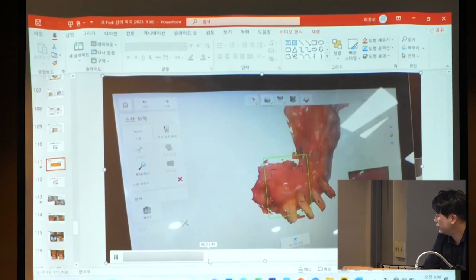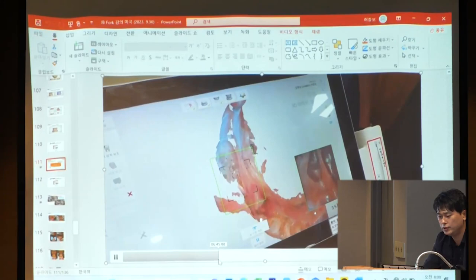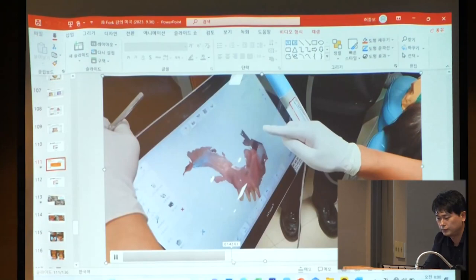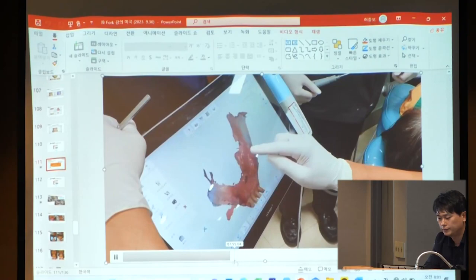There are remaining teeth, so there are many reference points for merging. It's very easy. After scanning the residual teeth, I check, and then I erase some extra data. And then I finish the lower impression.